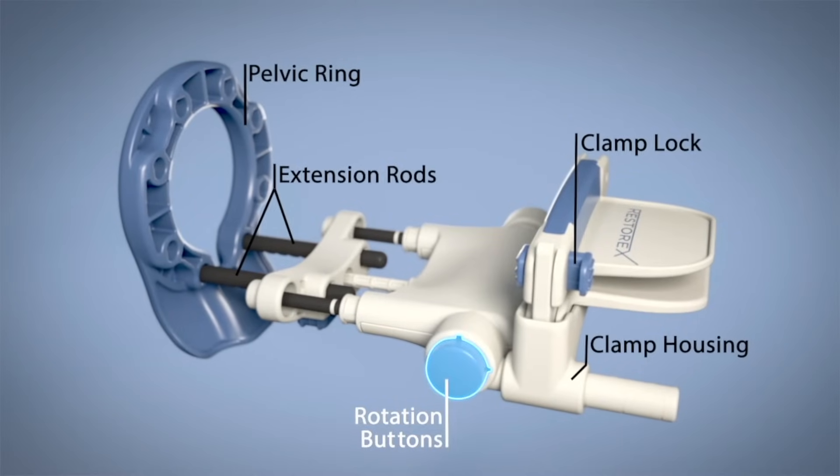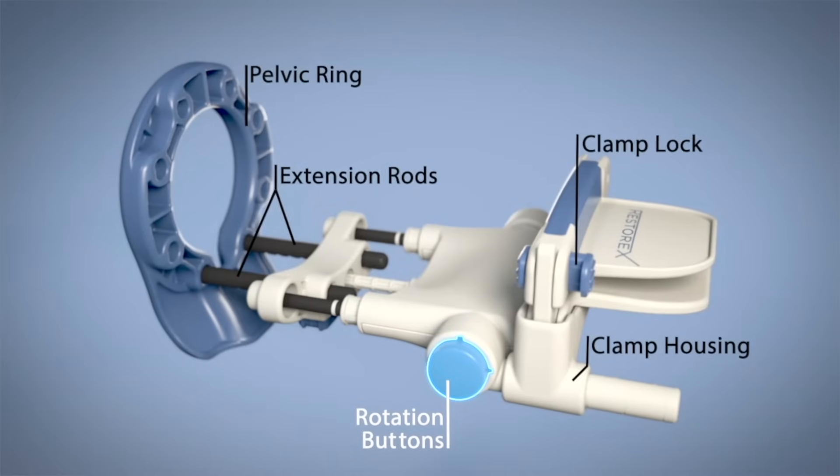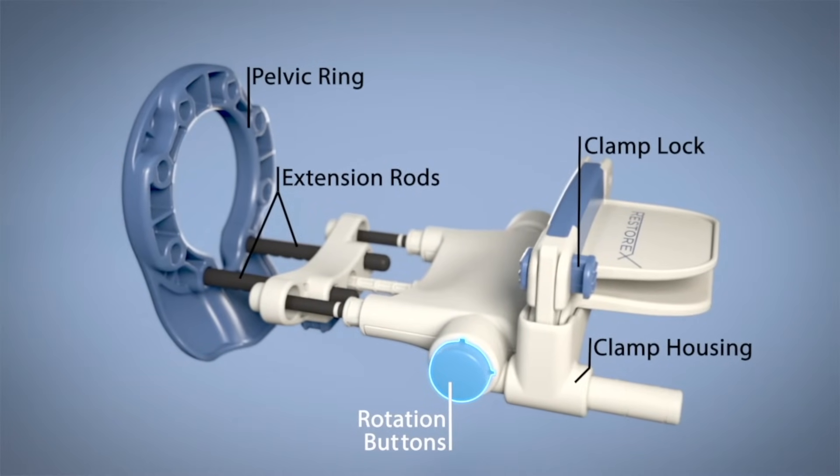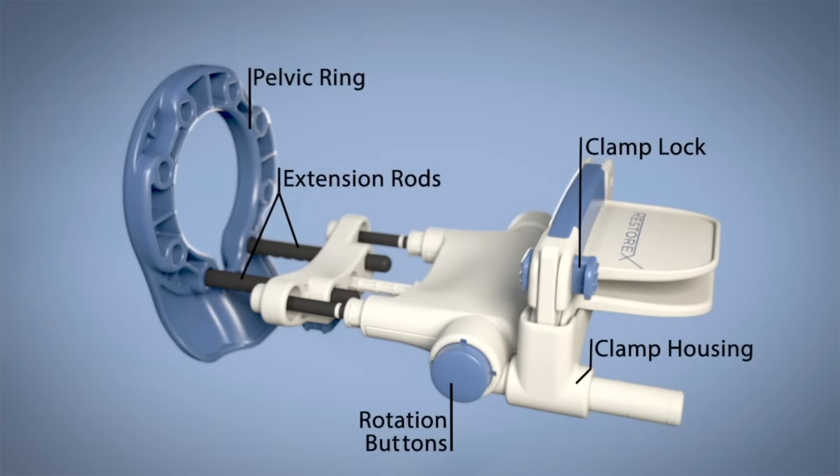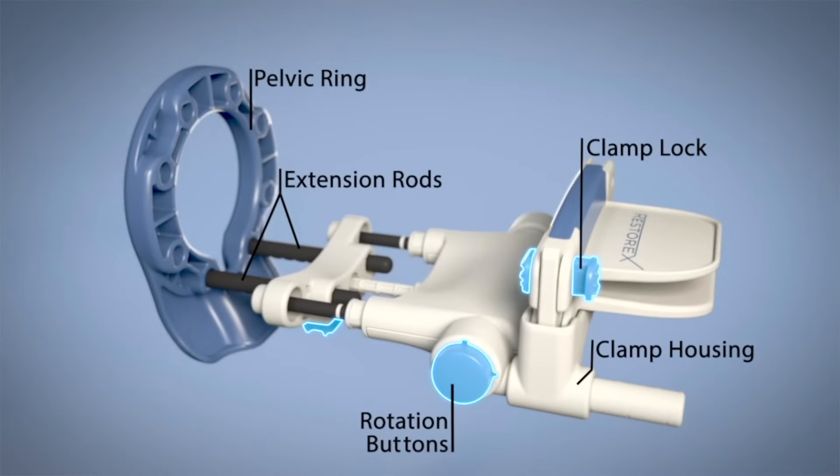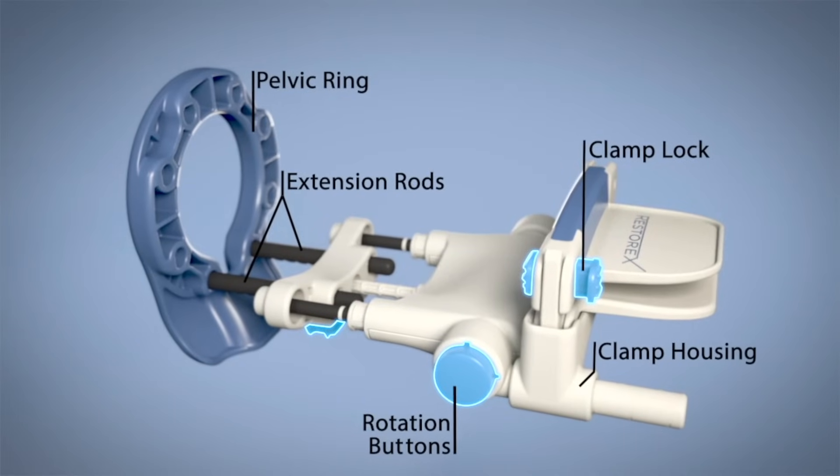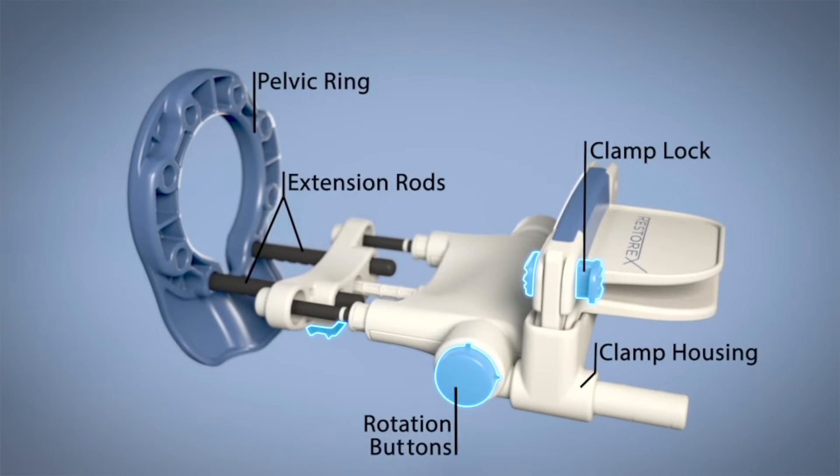The rotation buttons located on either side of the device are pushed simultaneously to rotate Restorex, providing opposite angular force to correct the curvature. The functional buttons are colored blue and are used to secure the clamp, release the extension rods, or rotate Restorex for opposite angular force.